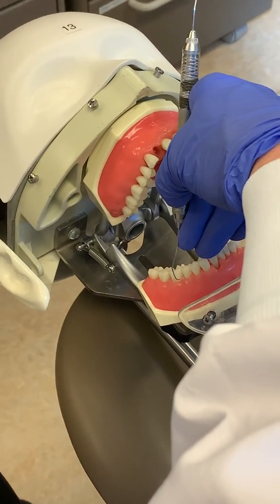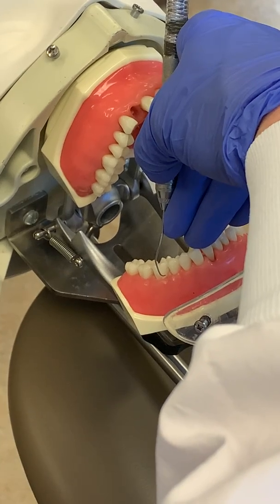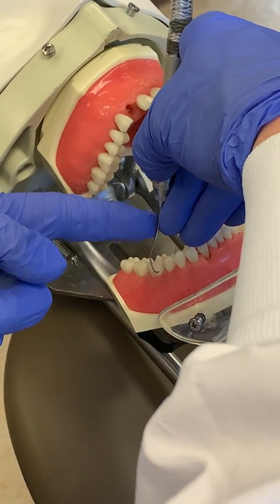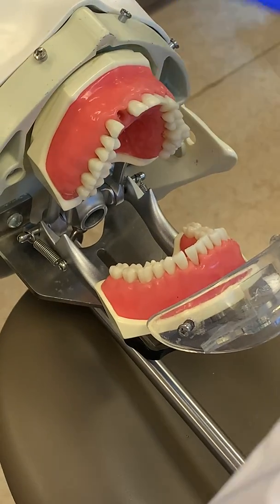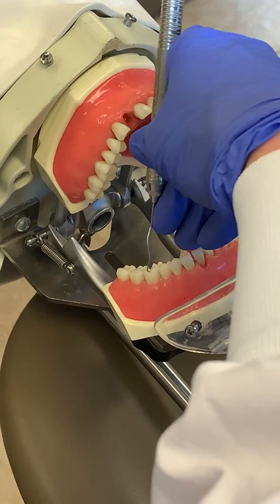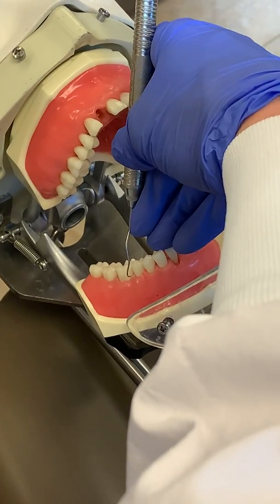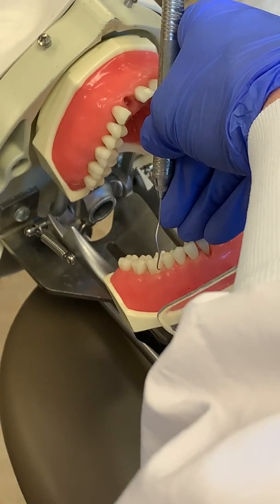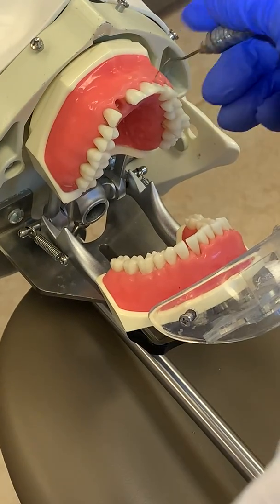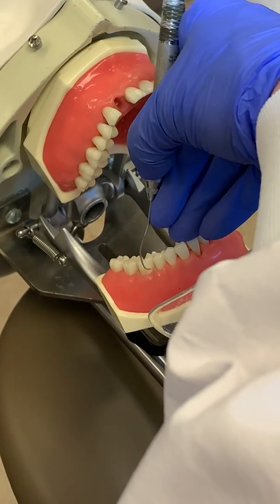This is the correct position because that bend in the shank points distally. As opposed to the wrong end — if I'm on the mesial and the handle is going out of the mouth like that, you can see how the bend points forward towards the anterior. That would be incorrect. So go back to the end where that bend points distally, and check it on the mesial every time.